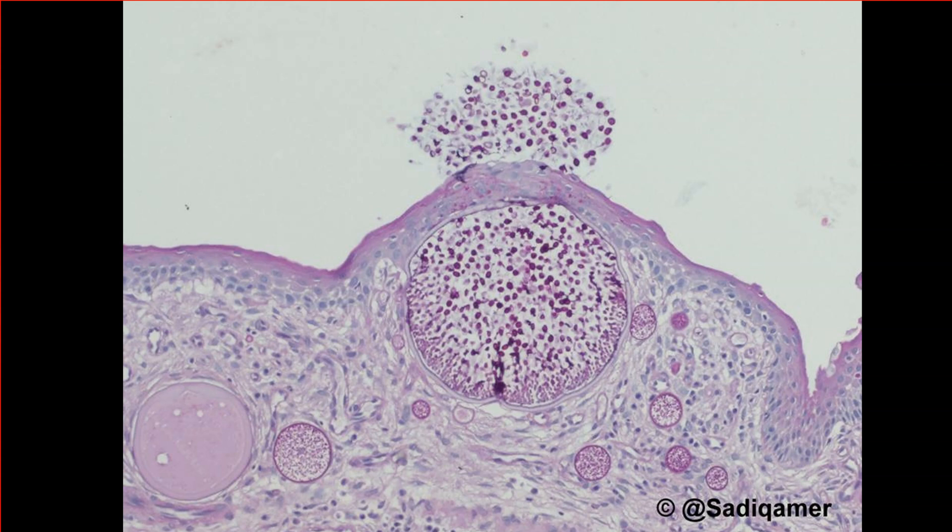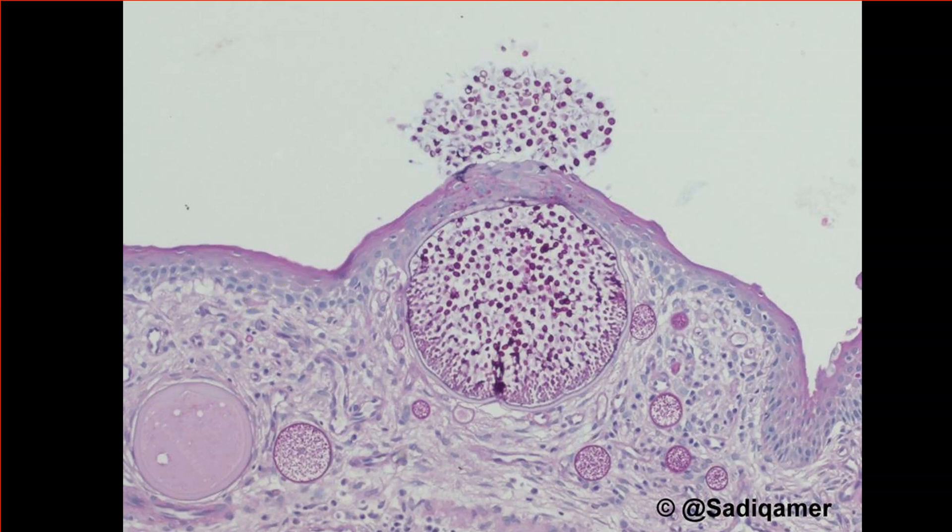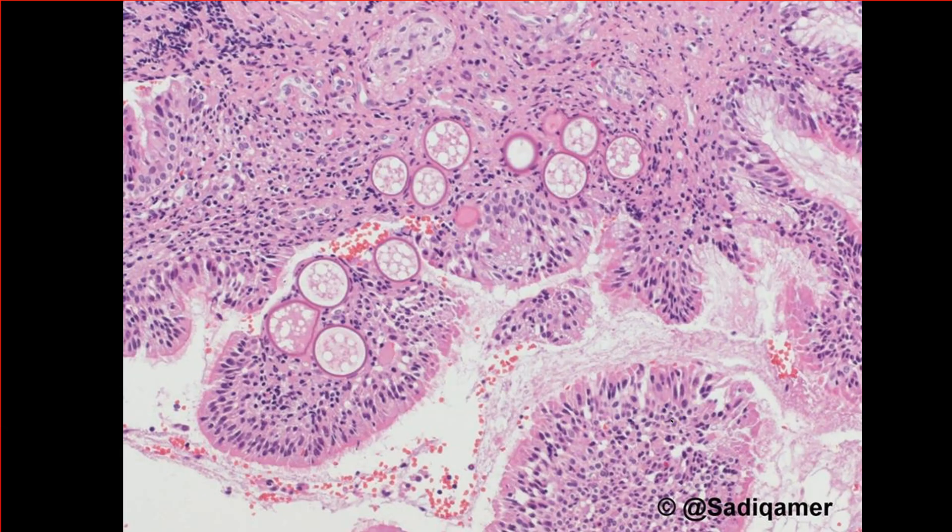So maybe you haven't either, but it's a pretty characteristic thing. I love this one because it's like a volcano erupting out into the nasal cavity. This is the stratified squamous portion of the nasal mucosa here, and you can see there's a large sphere filled with multiple little dots that are pink on PAS stain. And then there are smaller sphereules around here, and there you can see it involving the respiratory-type mucosa.